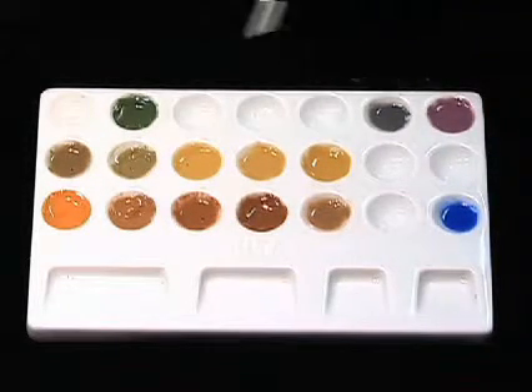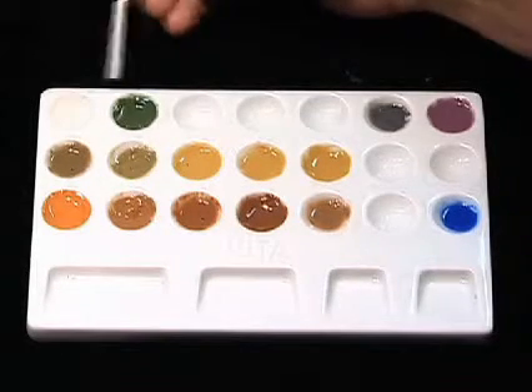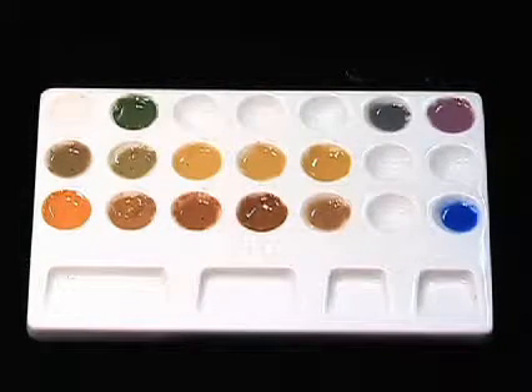If you look at the top row, this top left actually is white, which may be difficult to see on the monitor, but we've got white and green. These obviously are for opacities. Green is sometimes a color modifier that's useful to get some of those CD shades. We don't use it too much, but occasionally we need to use it.